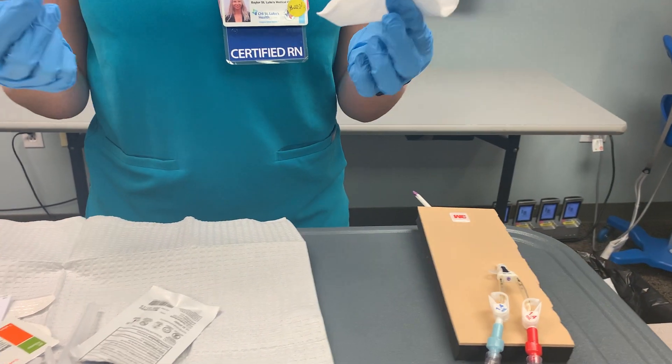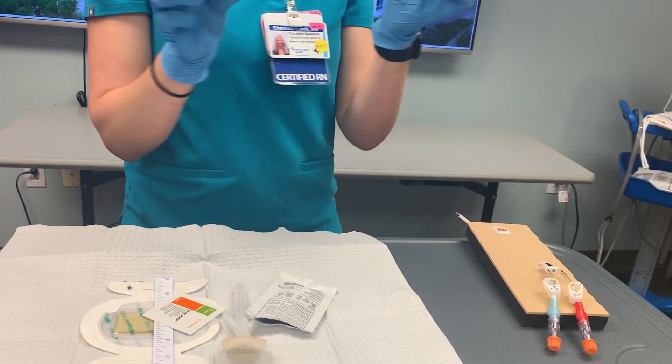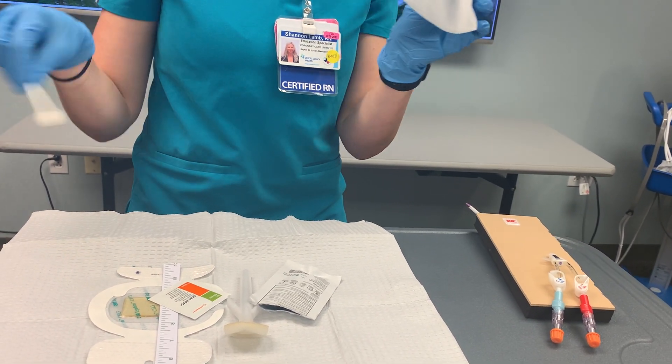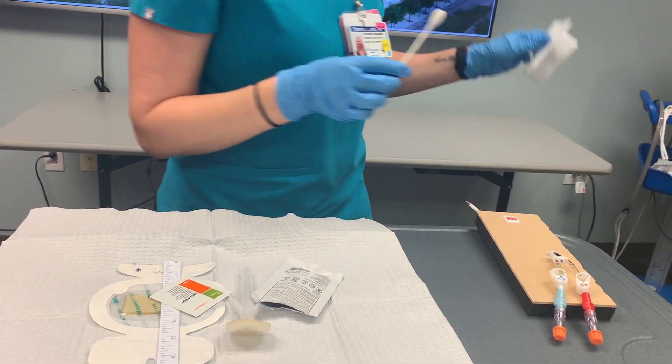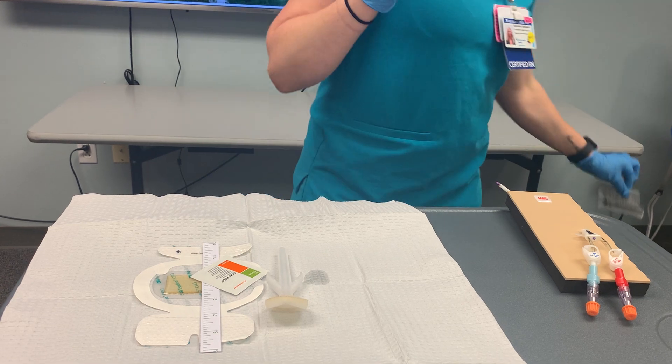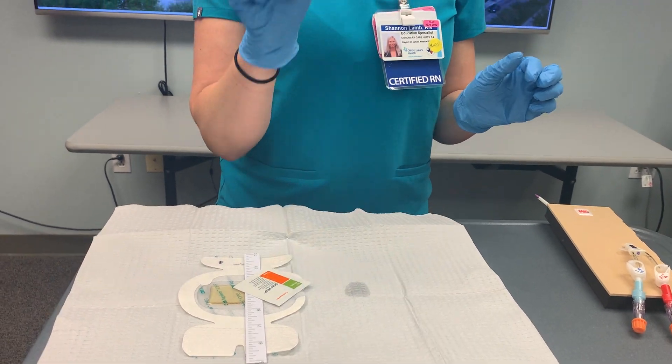We'll allow all that alcohol to dry for 15 seconds. I'm going to throw both of these things out — because this touched those lumens, it's no longer sterile, so I need to get rid of it so I don't contaminate my field. We're ready to move on to step 2, which is chlorhexidine.